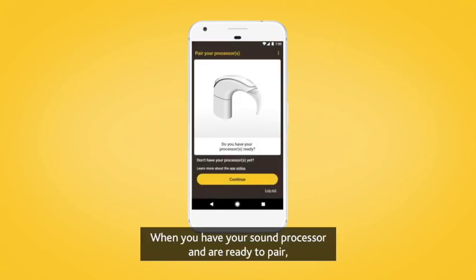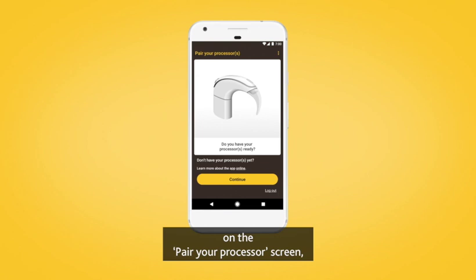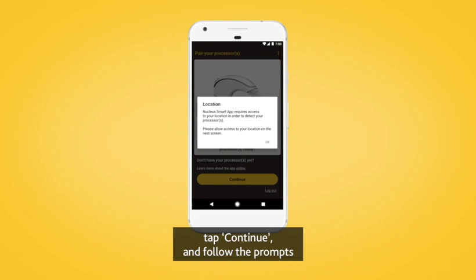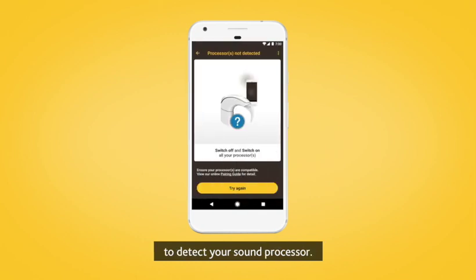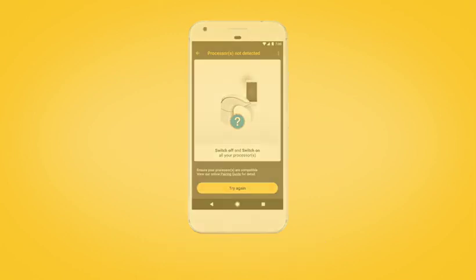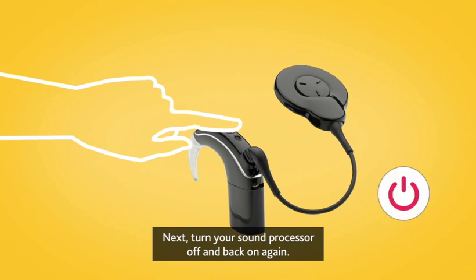When you have your sound processor and are ready to pair, on the Pair your processor screen, tap Continue and follow the prompts to allow location access. This enables your Android device to detect your sound processor. Next, turn your sound processor off and back on again.